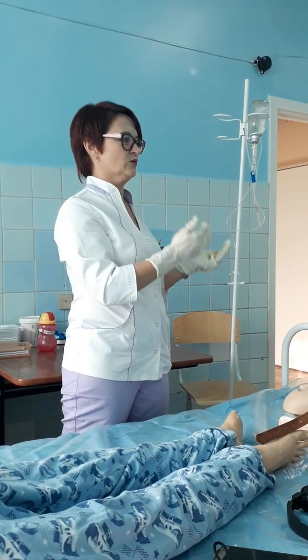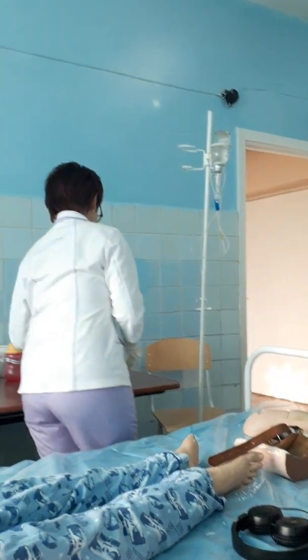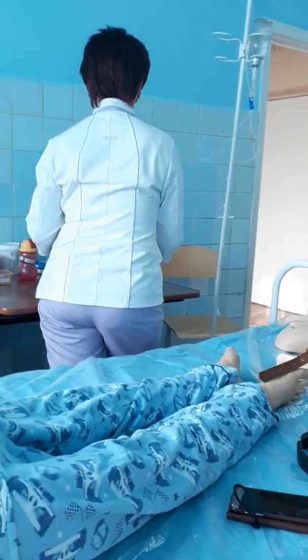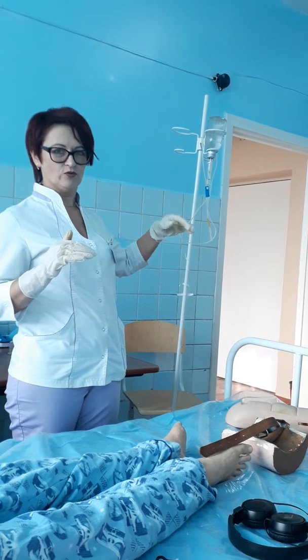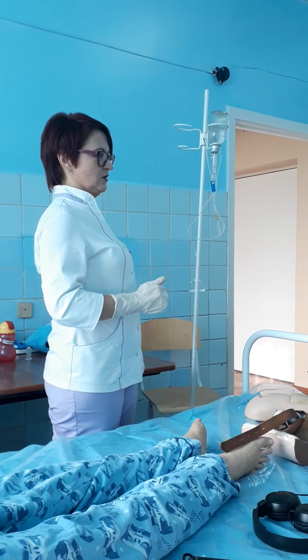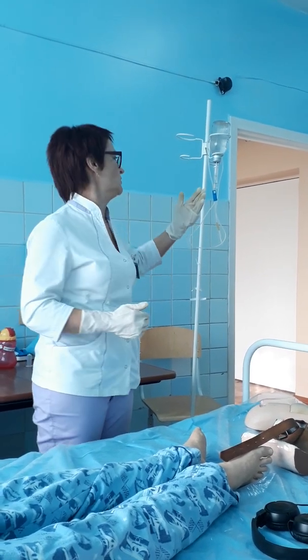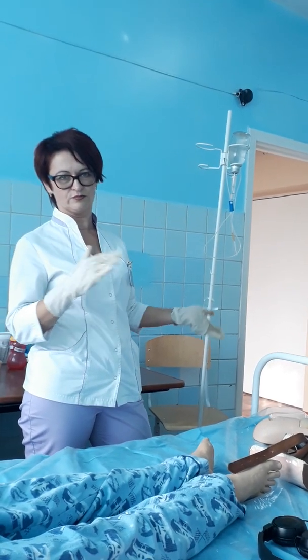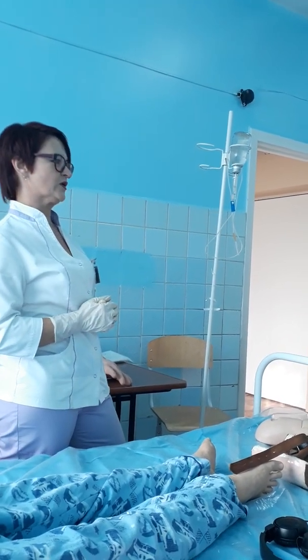Ask the patient about name, age, and other questions, allergic reaction. When you finish, explain to the patient what you will do, and name the medicine. Now I will give you an intravenous infusion, name of solution. Did you have this before? What do you feel? And other questions, and after that you explain the position.